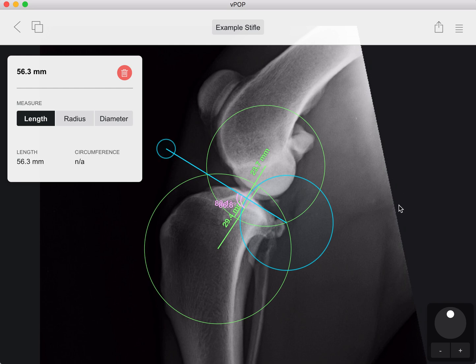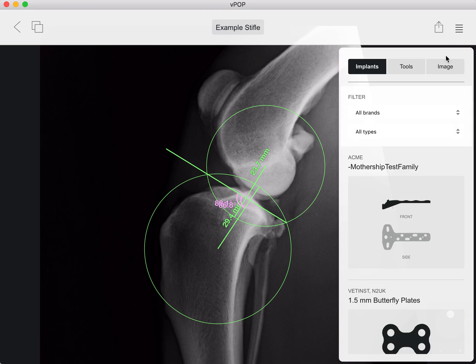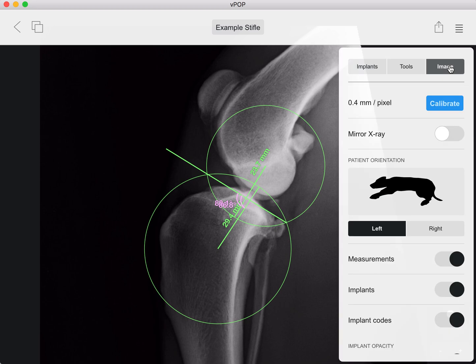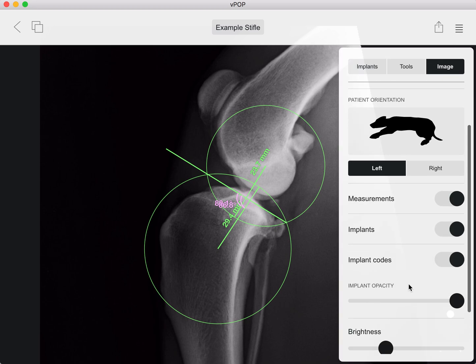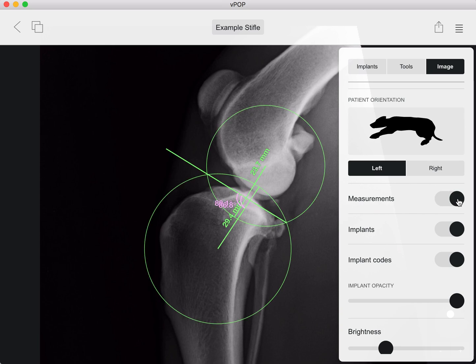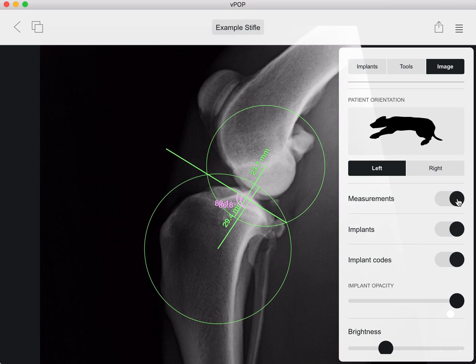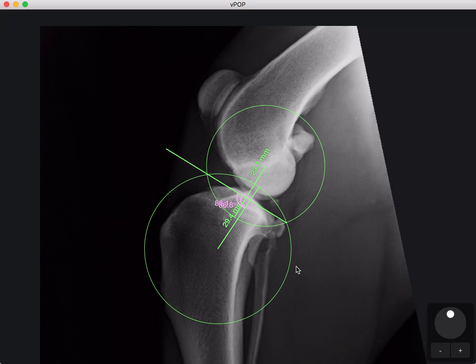If at any time you want to remove the circles, just go to your menu, then image, and you can toggle the measurements on and off here. So that's the circle tool in VPOP Pro. Thank you very much for your interest.